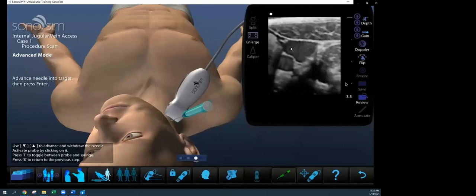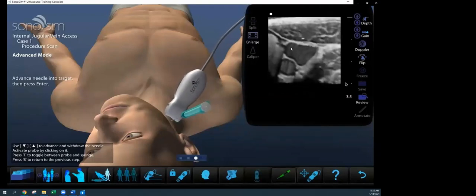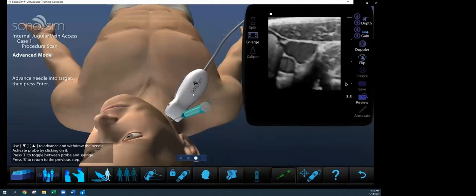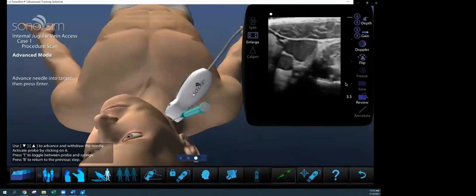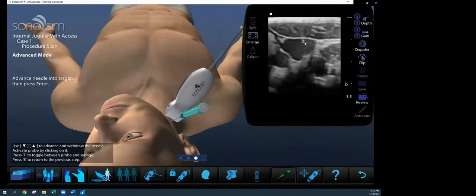So here I'm going to fan towards the vein. I'm going to start to advance the needle, and I'm going to look to see if I can identify the needle tip. And I see the needle tip right there, right on my needle screen. I'm going to fan the probe away till it disappears. Now I'm going to advance the needle. I'm going to fan my probe away till it disappears, and advance my needle again. Now I know I'm in the vessel, and I've quote unquote walked the needle in using out-of-plane guidance.